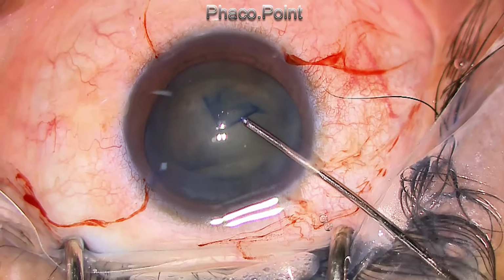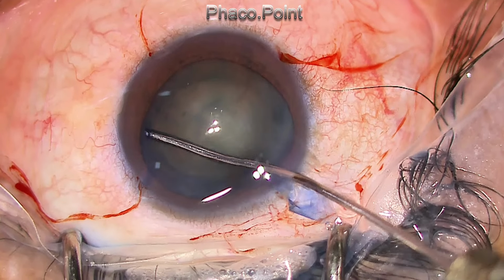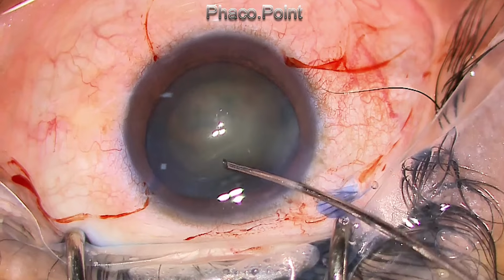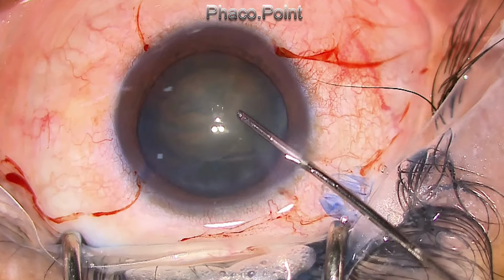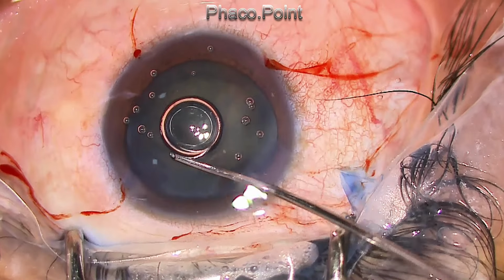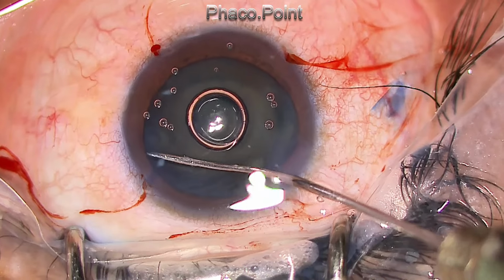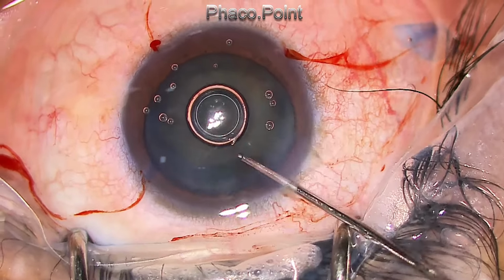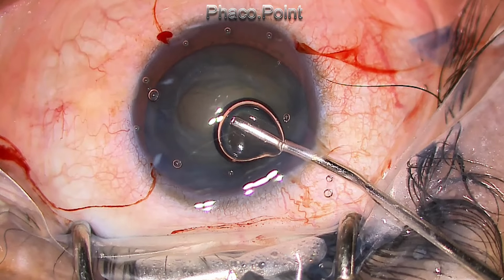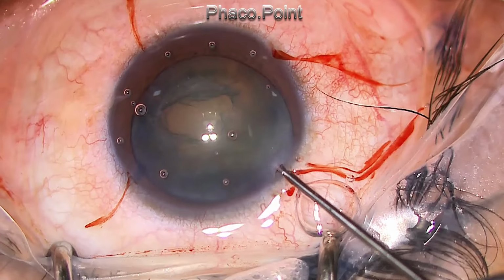And then I did the cortical cleavage hydrodissection. I know that there is going to be a weakness of the equator of the lens, and although there is a statement that we need to put the CTR as late as possible and as early as feasible, I believe that the CTR should go in as early as possible, simply because in zonular dialysis, the weakest part of the lens is the equator. And if you don't support the equator by a stretch, you're going to make this equator come into the phaco probe while you're emulsifying the nucleus.